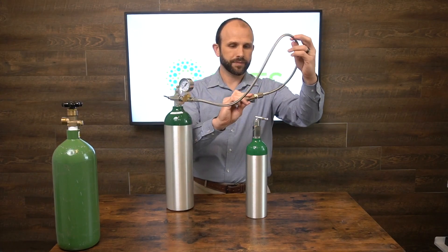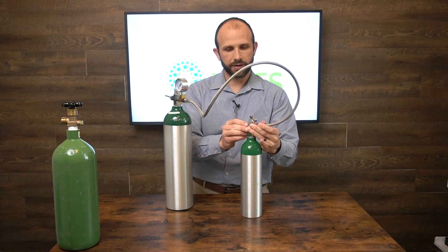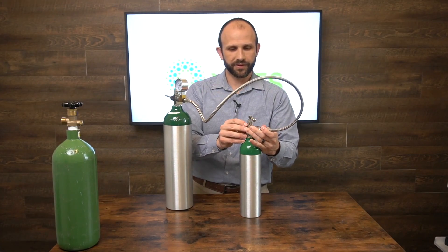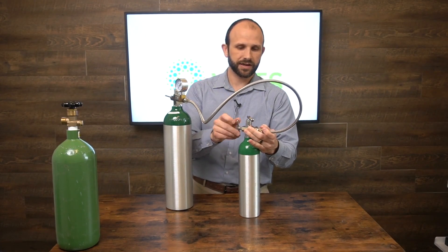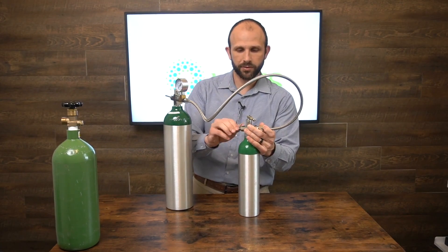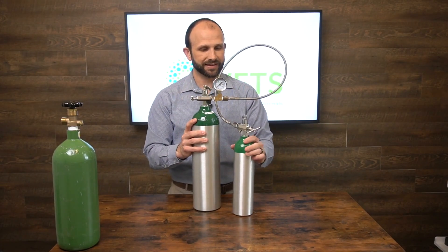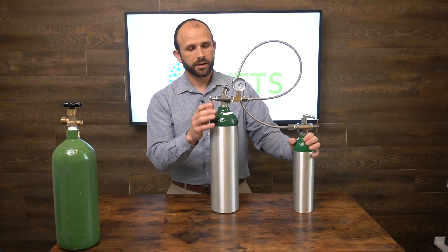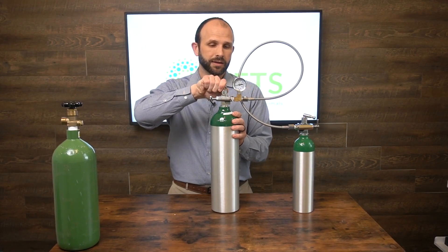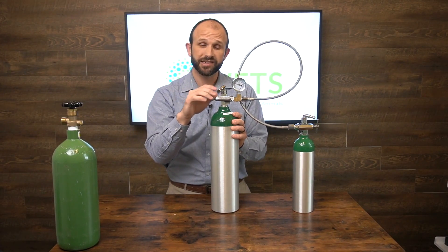I do recommend doing this in a place where your oxygen tanks are not going to fall or get away from you. I've got both tanks connected here now, and I'm going to open this tank — the gauge pops up and shows me how much oxygen is in there.